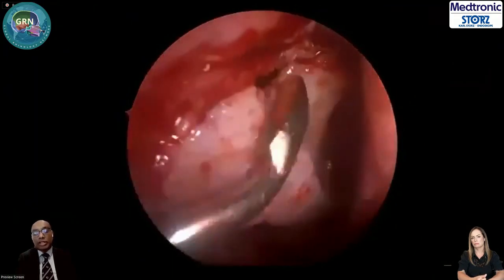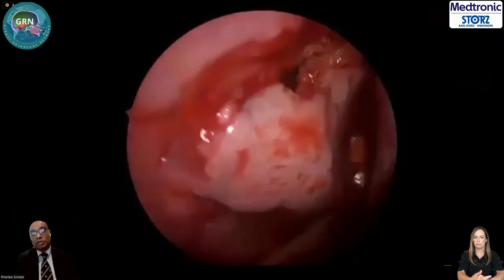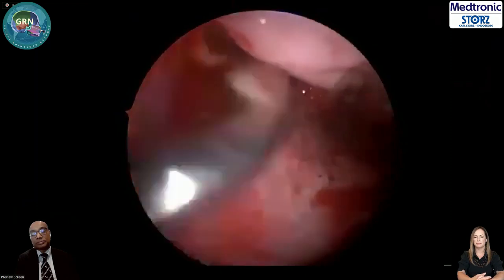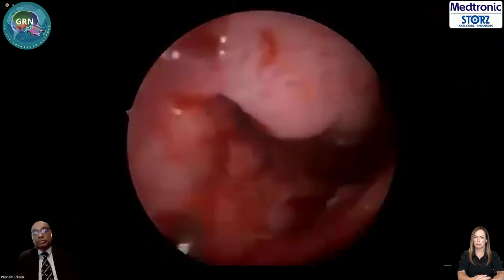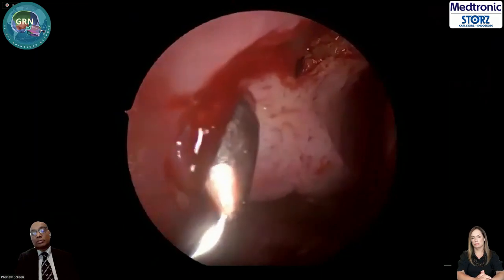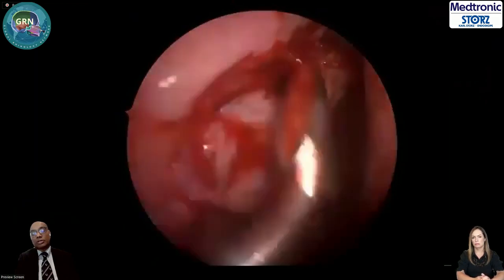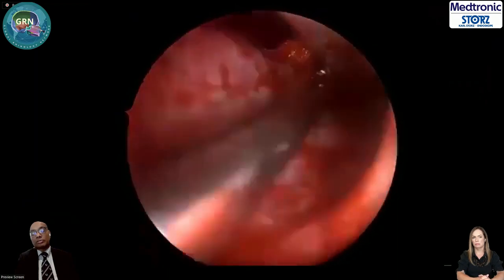Yes, thank you. I can see how you left a bit of bone as well, so it acts as a support and doesn't collapse. Yes. That's interesting. We drilled a bit more, but I think that there is no problem, because this can close by secondary intention.